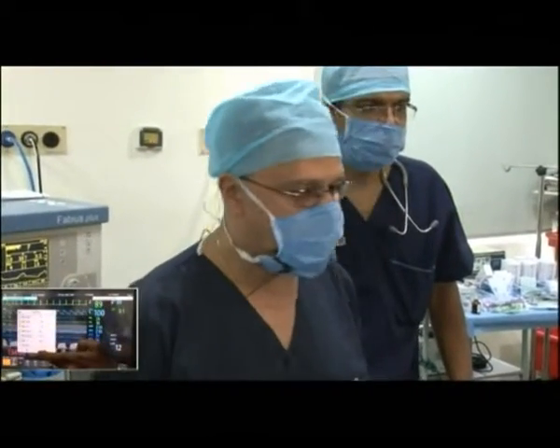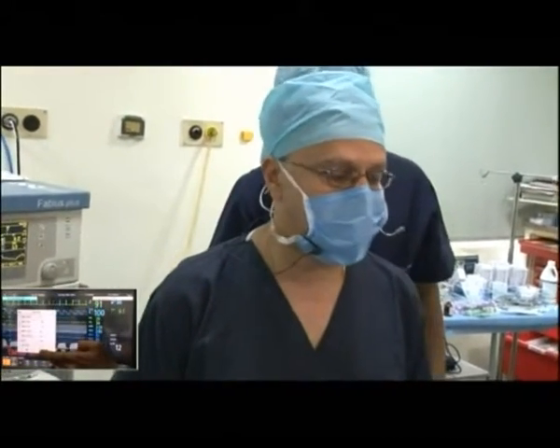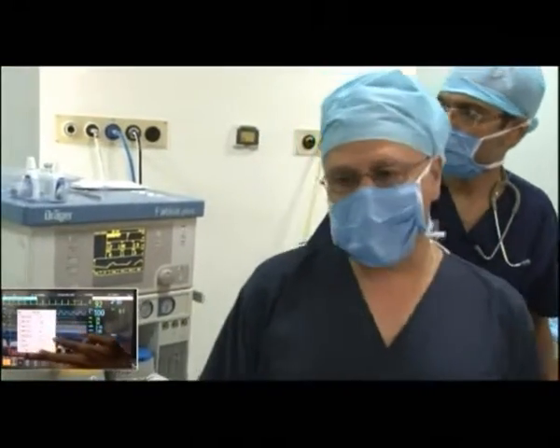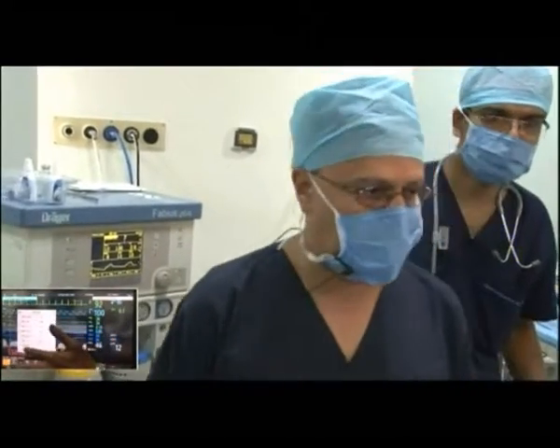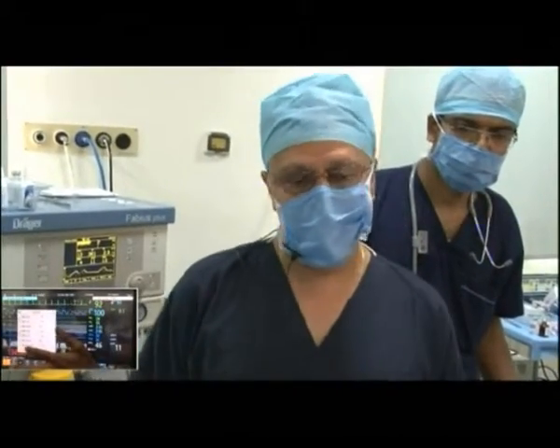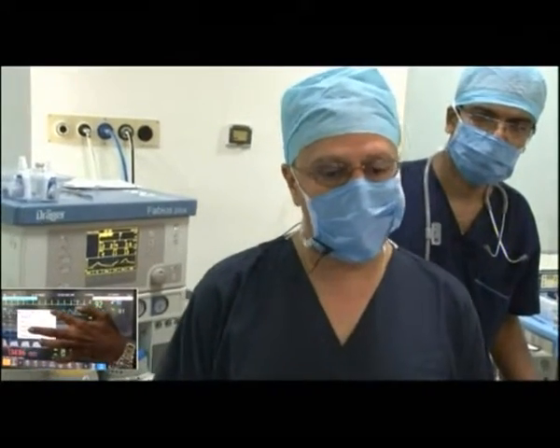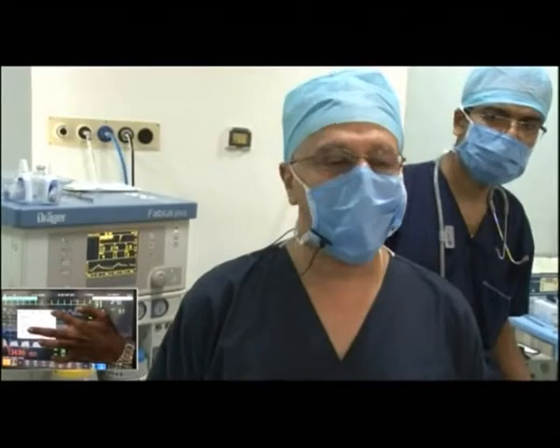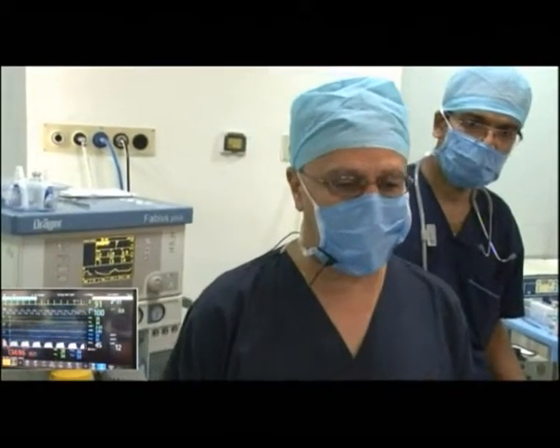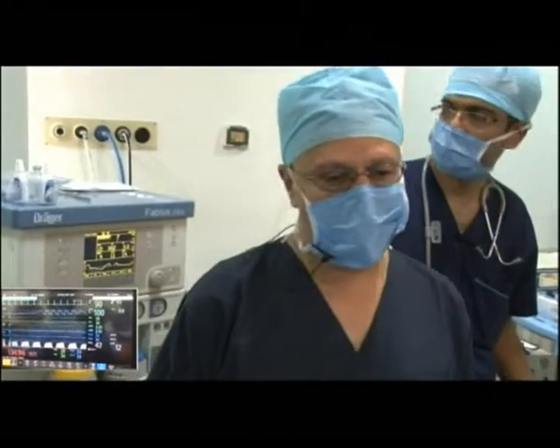Good morning, sir. One question for you. What are your ventilation strategies when you do lap surgeries? Again, for all procedures, whether it's laparoscopy or open procedures or this kind of closed procedure, we use lung protective ventilation. That means we use tidal volumes around 6 to 8 mL per kilogram, PEEP of 5, and respiratory rate to achieve an end-tidal CO2 around maybe 40 or so.